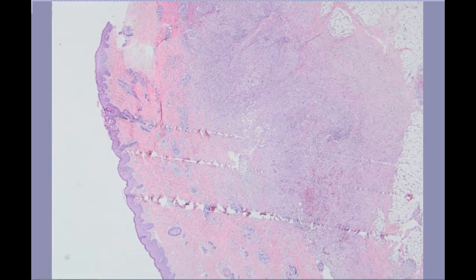Initially, a small punch biopsy was performed, which did not reveal a lot. So later on, they decided to excise one of the lesions in the skin, which is the specimen we are looking at right now. And over here you can see that the infiltrate actually involves predominantly the deeper dermis and also involves the subcutaneous fat tissue.